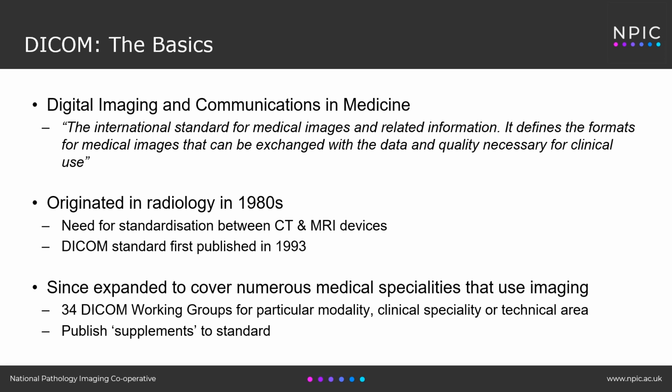It's since expanded to cover numerous medical specialities, and it's now implemented in almost every radiology, cardiology, imaging and radiotherapy device, and increasingly devices in other medical specialities, including ophthalmology, dentistry, dermatology, surgery, and now obviously digital pathology. These are covered by 34 working groups which develop and publish supplements to the standard pertinent to these different specialities.